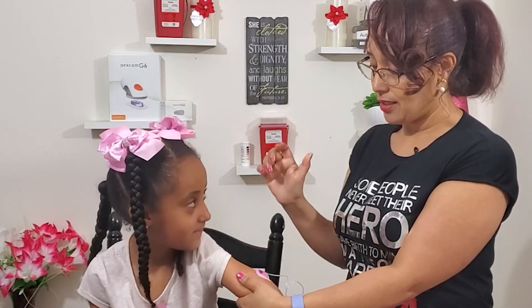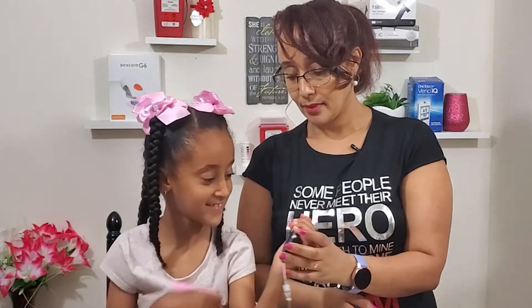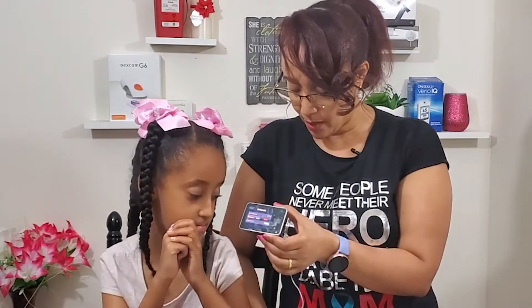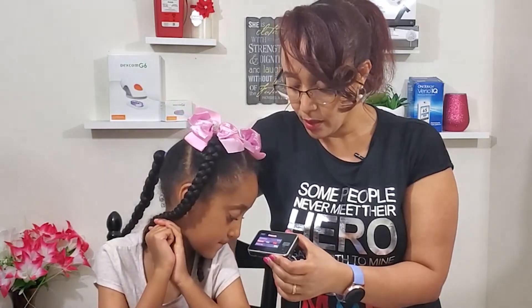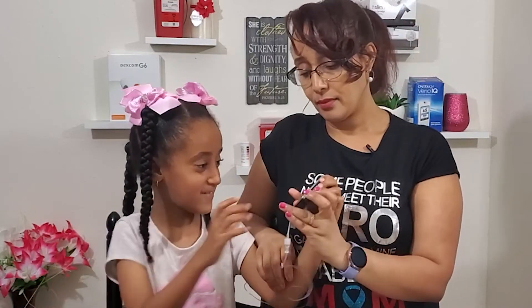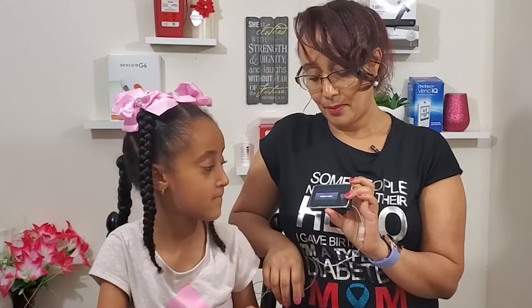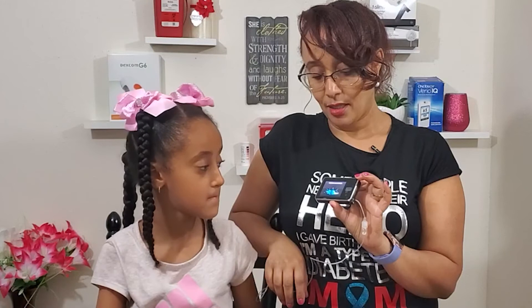One click — there we go. Next step: fill. Start filling. Then click done. So you click on done, and then resume insulin. Resume. That's it.